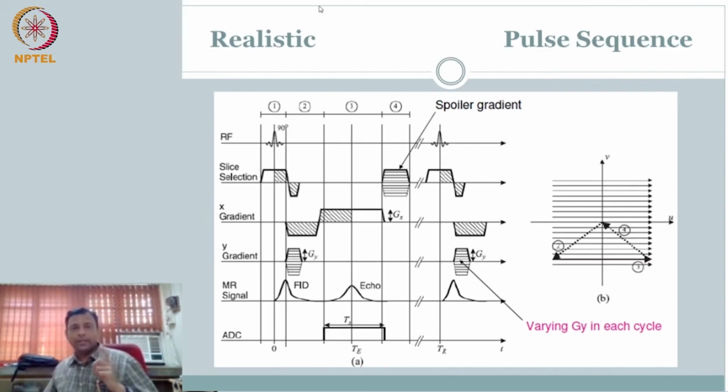Last but not the least, did you get a chance to realize what this should be? So realistically, what sequence are we talking about? Straightforward. Pay attention to the detail. What is the signal I am reading? It's an echo signal, so it has to be some sequence with echo. The echo is due to what? I don't see a 180-degree pulse here. Previously, I know if there is a 180-degree pulse, then it is a spin echo. Now I see an echo, but this echo is coming because of the gradient switch. So this is a gradient echo: a realistic gradient echo pulse sequence.